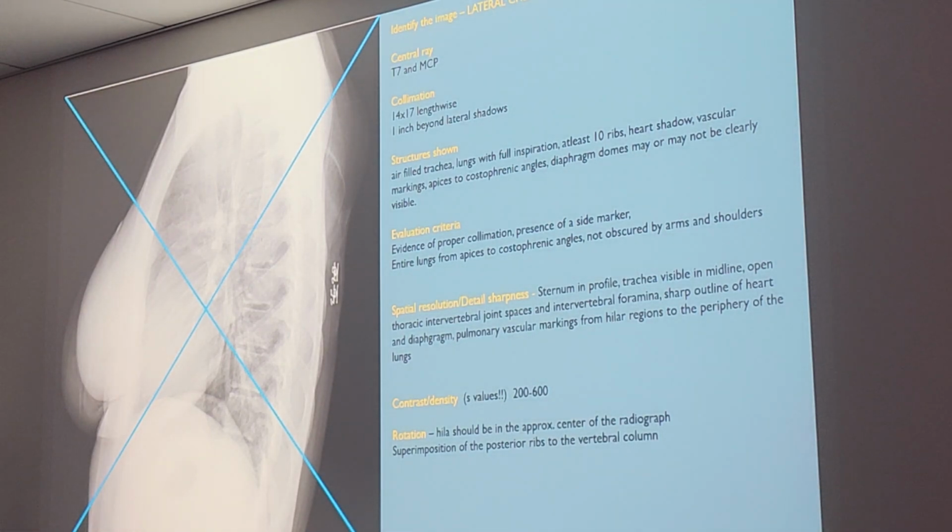Yes. Hey, I just had a question on rotation. I don't know where I read it, but pretty much that's about the max allowance of allowable rotation, correct? The rule of thumb is it shouldn't be more than your fingernail. And that's when we're looking at the image, like on our screen? Mm-hmm. But when is rotation acceptable on a patient? Be more specific.